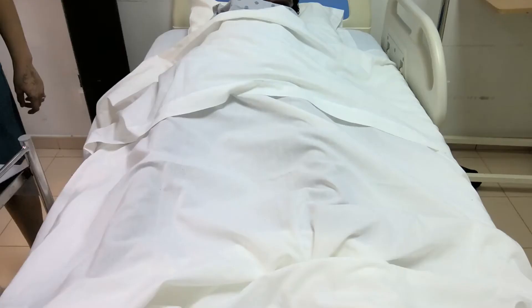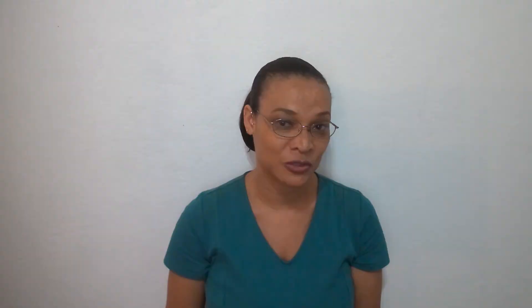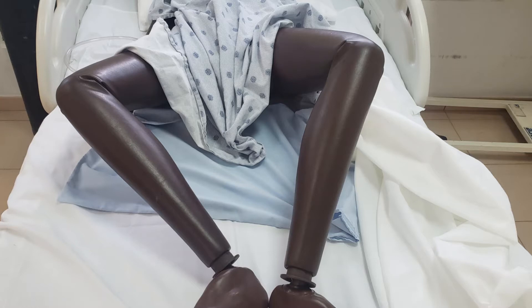Assess the client's overall condition, determine if the client is able to participate and hold still during the procedure, and if the client can be positioned in a supine position with the head relatively flat. For female clients, determine if she can have her knees bent and hips externally rotated. Determine when the client last voided or was last catheterized.